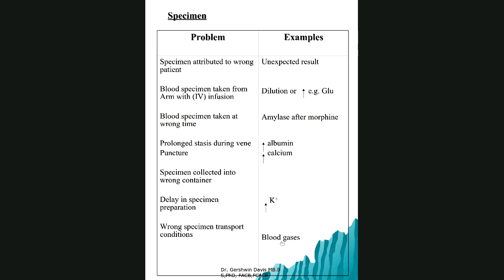Right? The machine is right in the next room. You just take the blood in your blood gas syringe, and you just put it in the machine, and you do your analysis immediately. Yeah. So that's just the practical and reasonable approach. Okay. Because these are just guidelines. You need to use the guidelines appropriately in your particular circumstance.